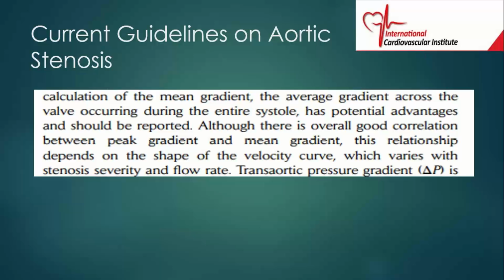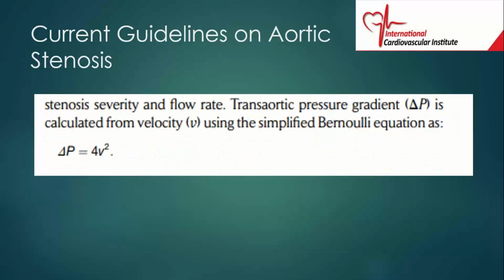The mean gradient has more clinical significance than just the peak gradient, because it is the average gradient across the valve during the entire systole, as opposed to the peak. So it's more clinically relevant.